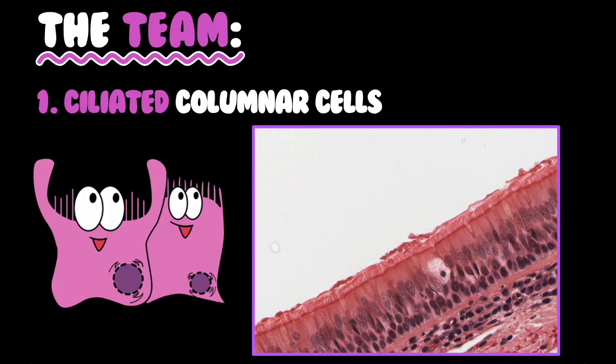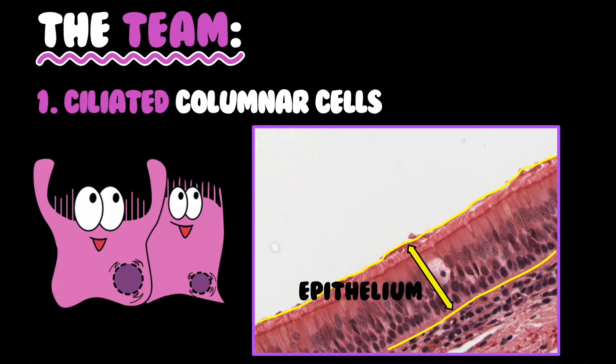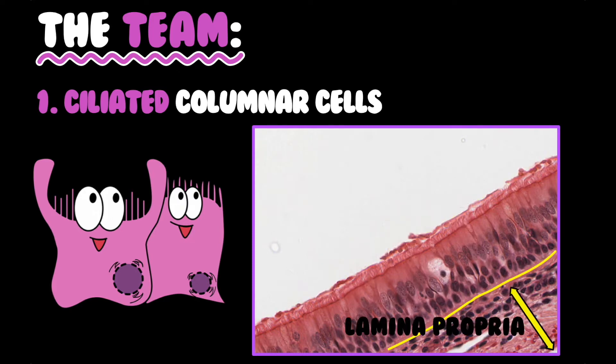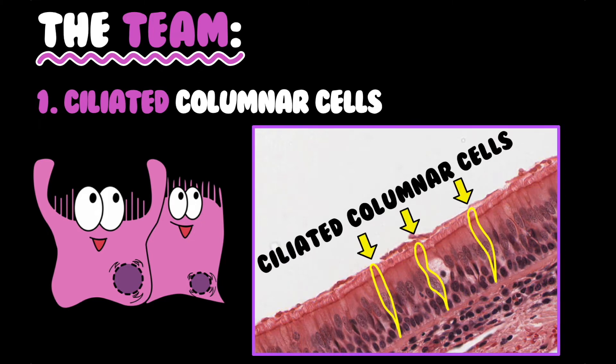This is our respiratory mucosa — our epithelium, the lamina propria, and the cilia. These are our ciliated columnar cells.